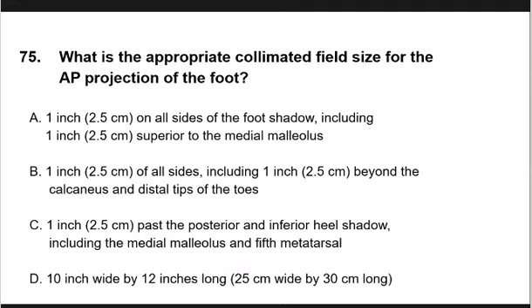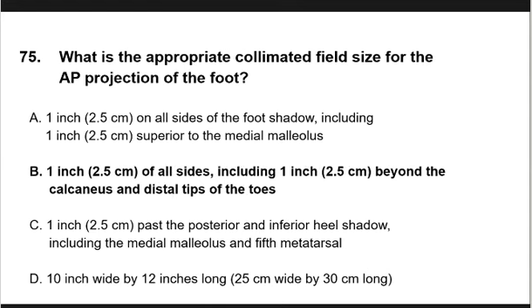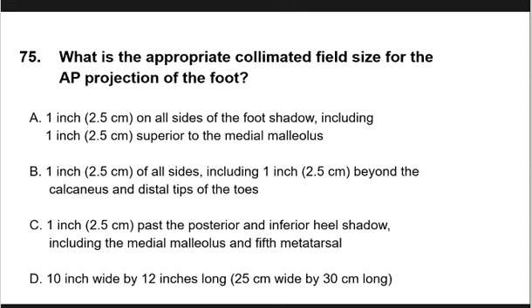Next question. All of the following projections can be used to image a patient with a suspected intertrochanteric fracture. Exact. So lahat daw ito ay ginagamit to demonstrate the intra or intertrochanteric fracture. Meron ditong isa na hindi ginagamit. Ha? So what is the answer here? That is, tama ba? Parang mali. Ano ba yan? So what is number 75 pala tayo, no?